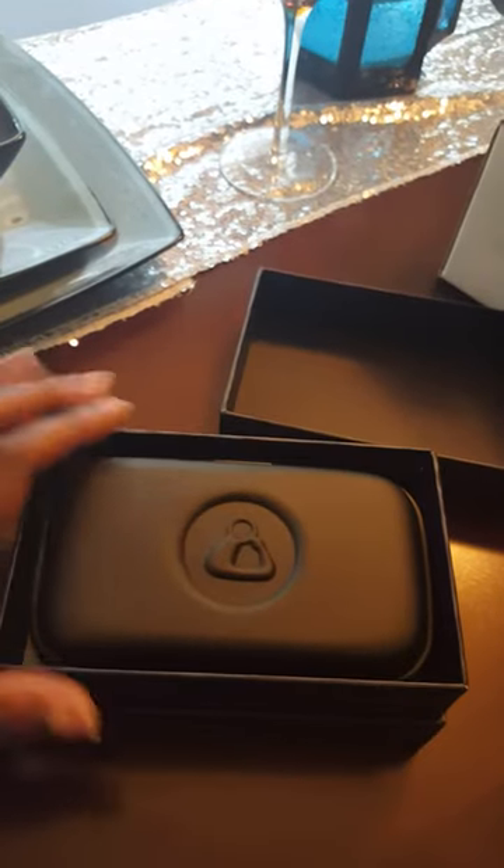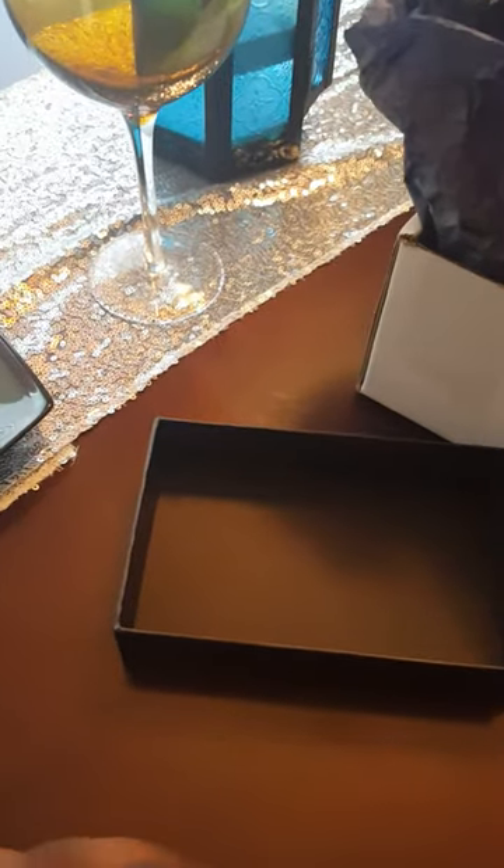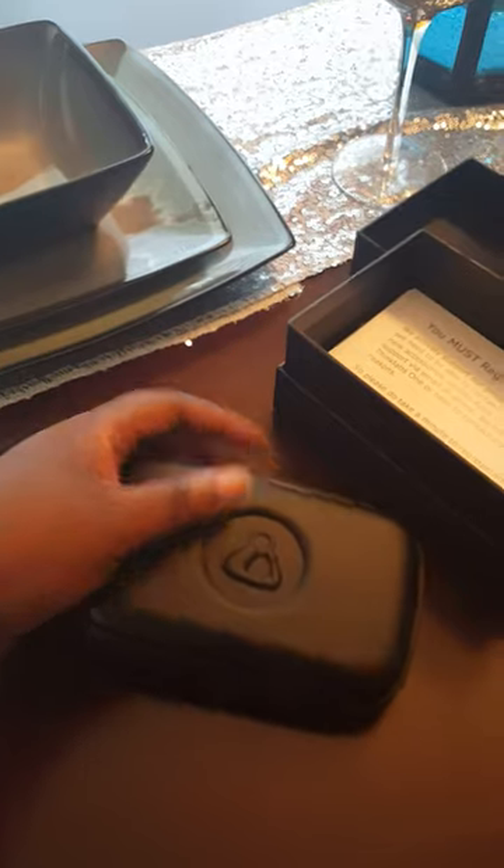This is a lot smaller than what I thought, which is a good thing because this is going to fit in my lab jacket perfectly. It just fits in the palm of my hand, so that is just perfect size.